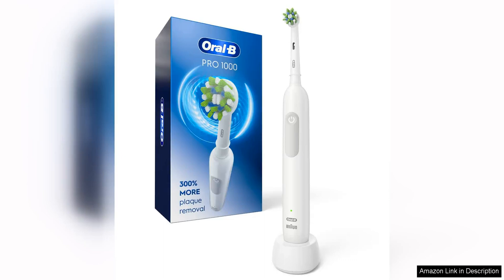The Oral-B Pro 1000 Rechargeable Electric Toothbrush in white is a solid investment for anyone looking to step up their oral hygiene game. This toothbrush offers a thorough and effective clean that leaves your teeth feeling squeaky clean and your gums healthy.